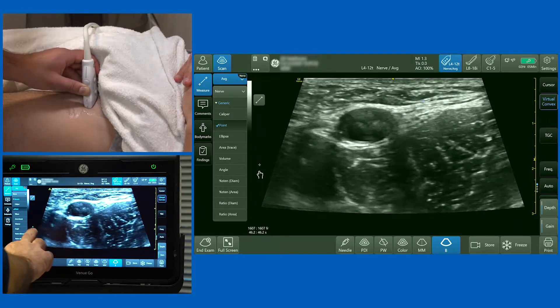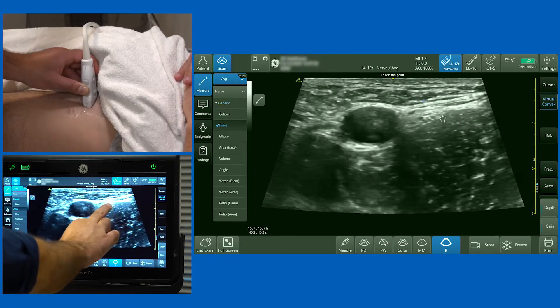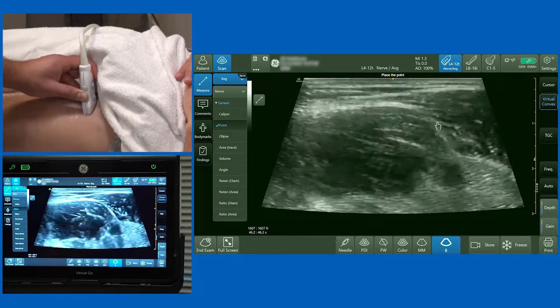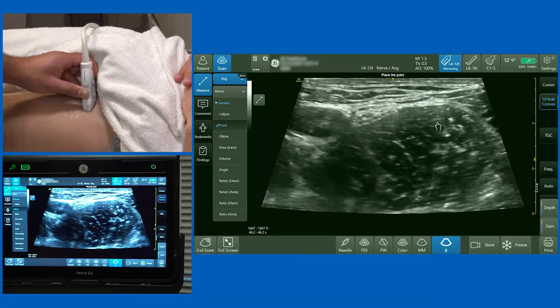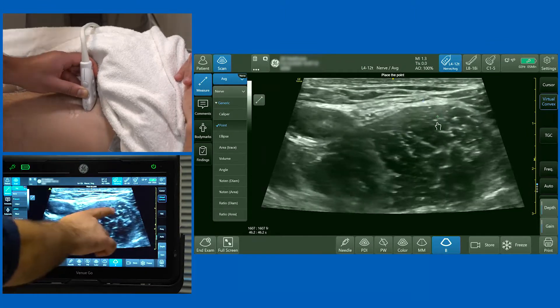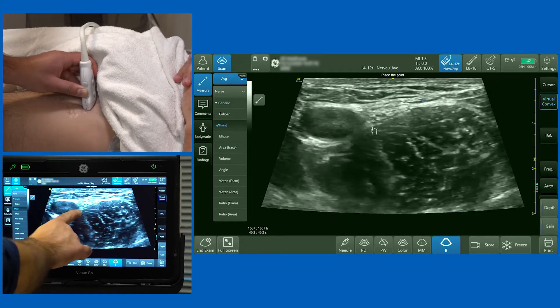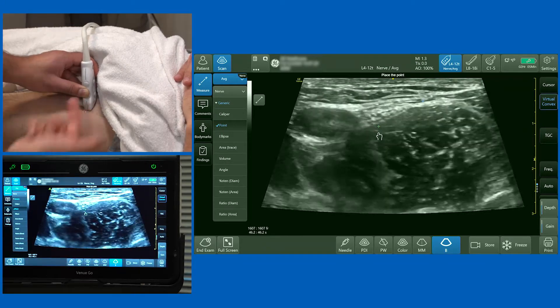As you move the probe north you'll see a single pulsatile femoral artery, and lateral to that femoral artery you can now see the femoral nerve lying right on the surface of the iliopsoas muscle. It's not unusual to see the nerve pressed right onto the fascia of that muscle or onto the surface of the muscle itself.